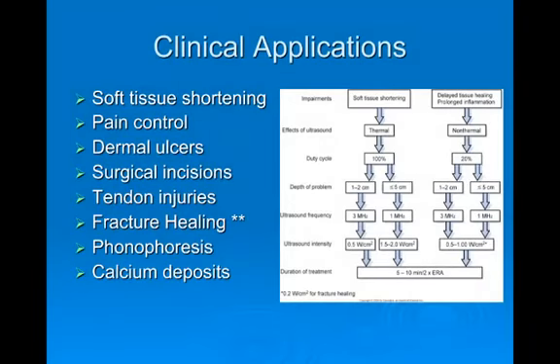All right, so let's talk about clinical applications then. So we've got a bit of a laundry list here of various things that ultrasound is used for. But the first major point is that there's just limited evidence to support most of these usages, but that's mainly due to poor research design and variations in dosage that were used. So it's very hard to compare. It's not apples to apples. It's kind of apples to oranges as you look across what people have done over the years.